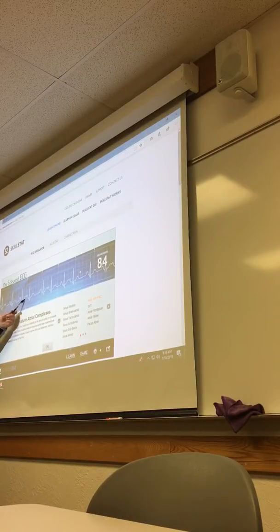Okay? So, but if you look at, let's say that this came a little bit before this, so that it was buried completely in the T wave. This T wave would look different than the other ones. So even though you saw one bump, if this one was higher, then you would know that there was a P wave buried in there. And it wouldn't come on top of the QRS in this instance.